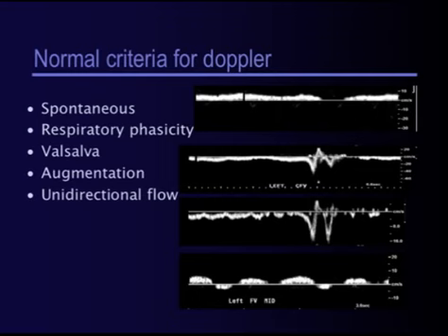Normal venous flow also changes in response to respiration. This is sometimes termed respirophasic. When absent, the flow is described as continuous. This may indicate the presence of obstruction proximal to the site of Doppler examination.